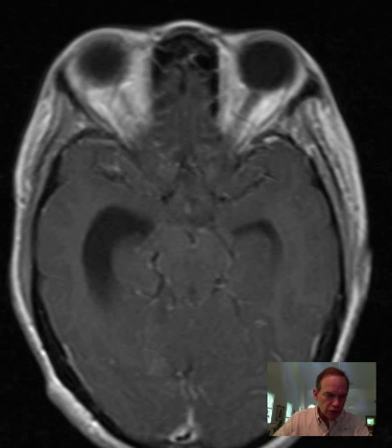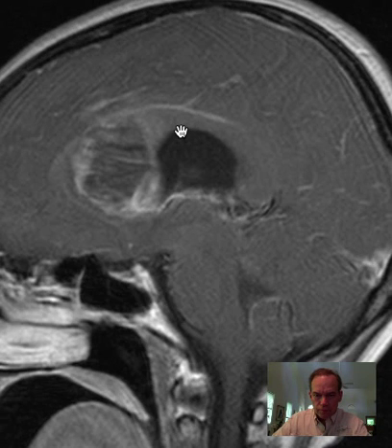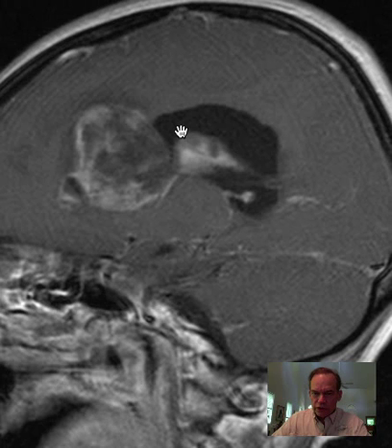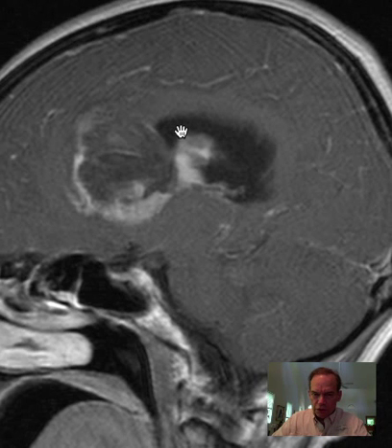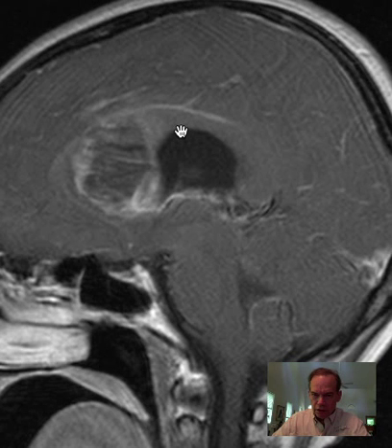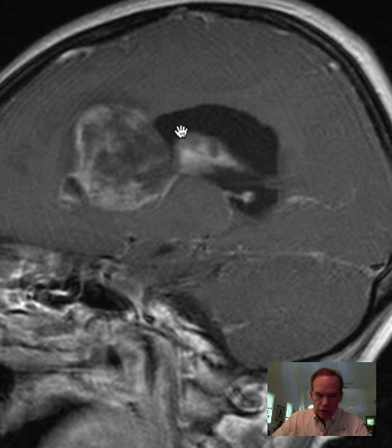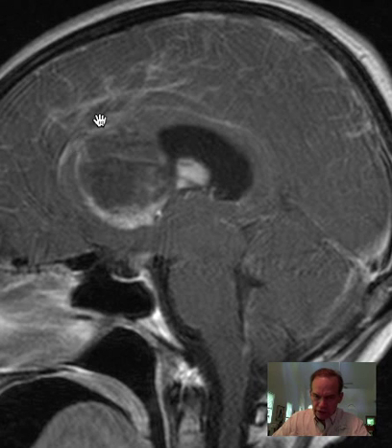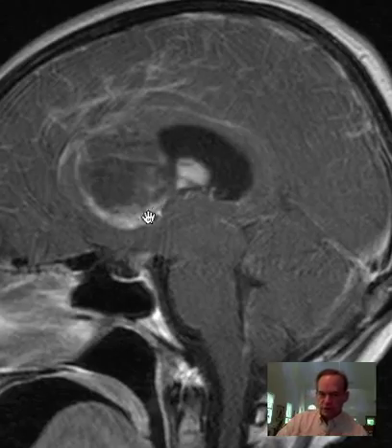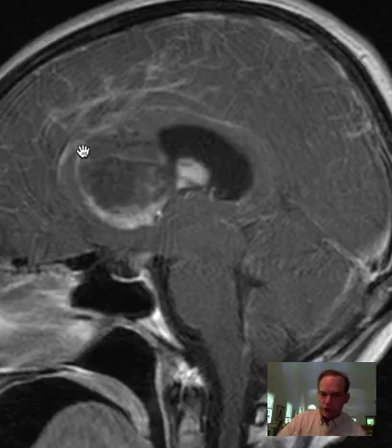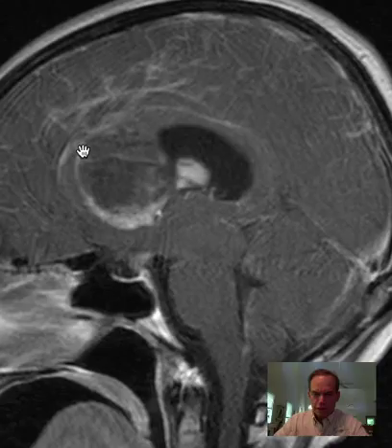Looking at the sagittal images, we can see that mass. Going from the right side toward the midline, and then to the left side — most of this bright signal is hemorrhage methemoglobin giving us this high signal, in this early stage of maturation of the hemorrhage.